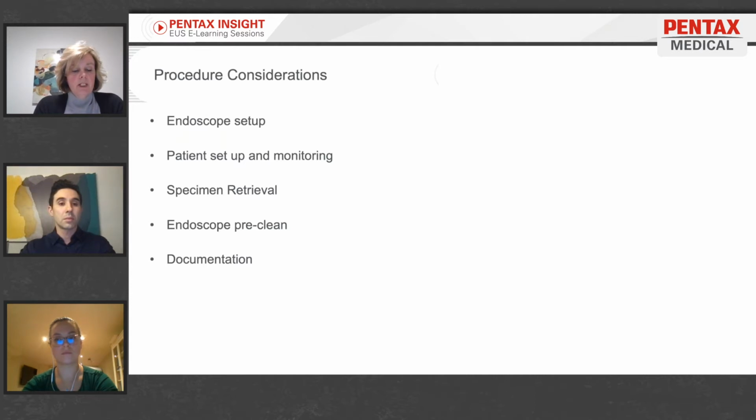And as for the patient setup and monitoring, it is very similar to other endoscopic procedures. Your procedural sedation policy should be followed. At our site, we monitor the patient's heart rate and O2 saturation constantly and their blood pressure every 5 minutes.